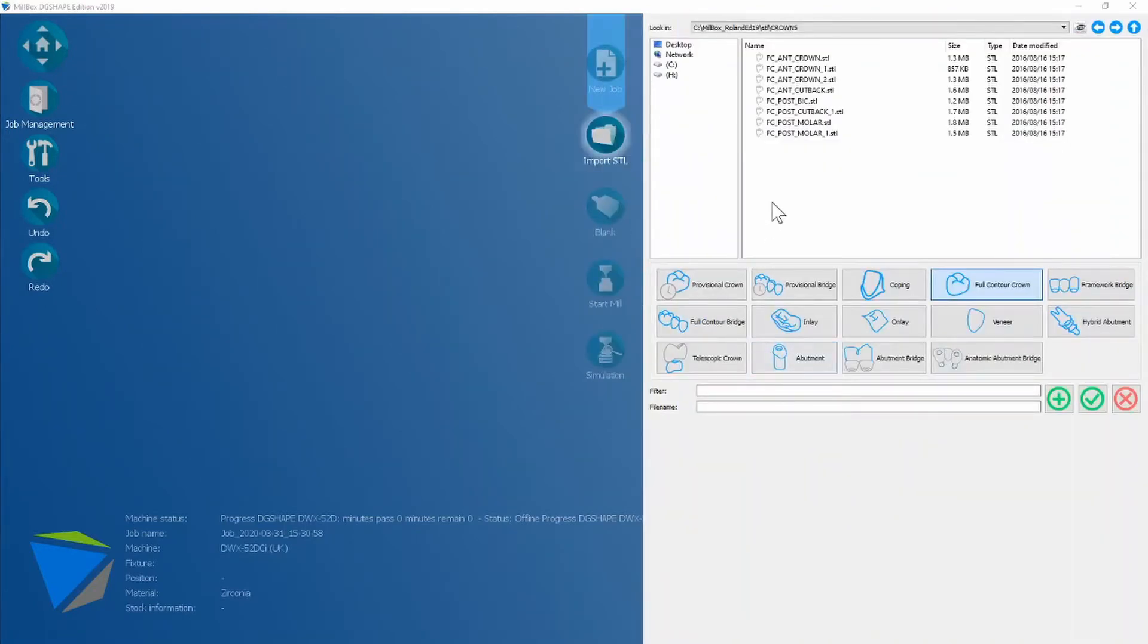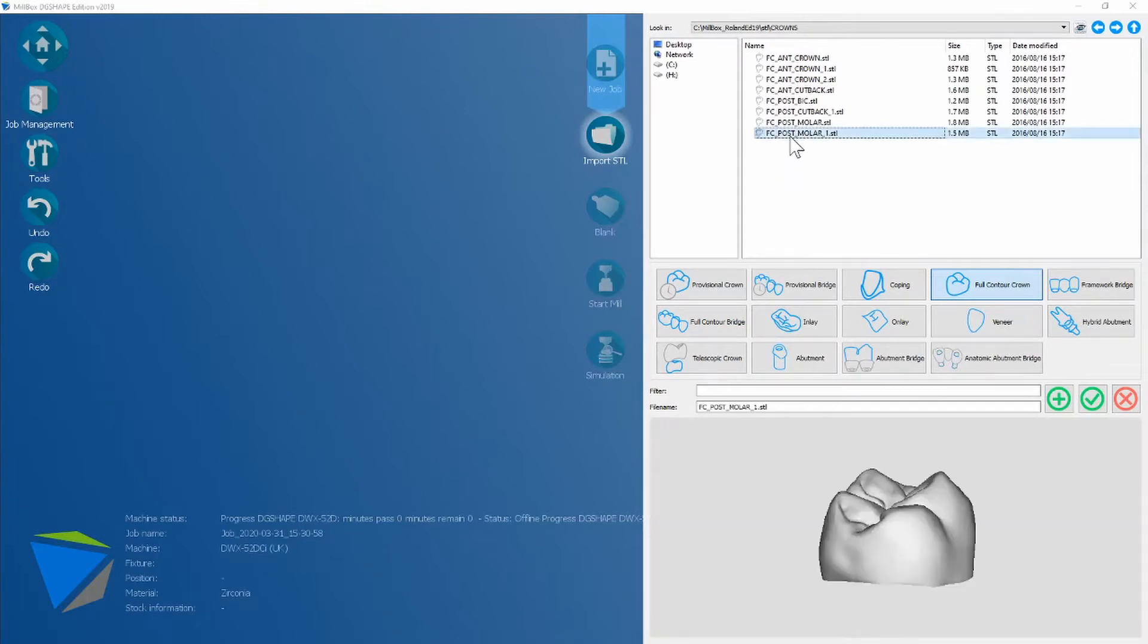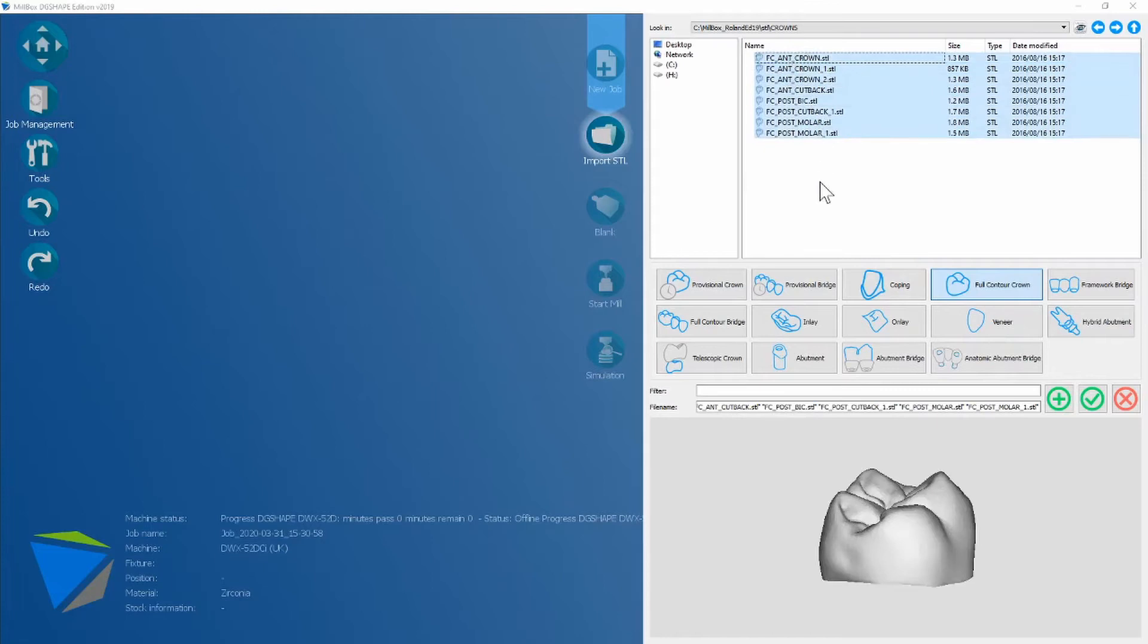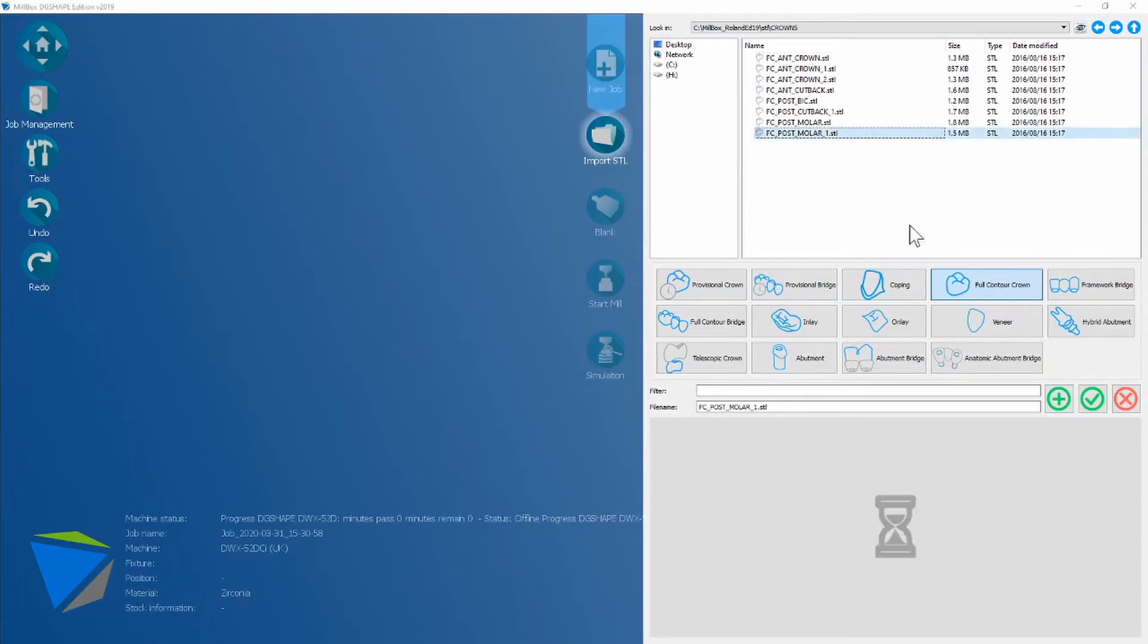The next part is STL import. I'm going to choose this full contour crown and I'm going to tell Millbox that it is a full contour crown for strategy selection. It's worth mentioning you can add a full list or you can use this plus here to add different types. Once you're happy you can then select next.